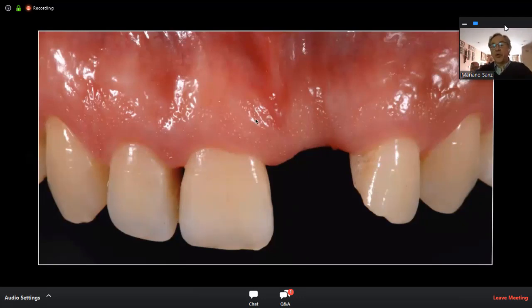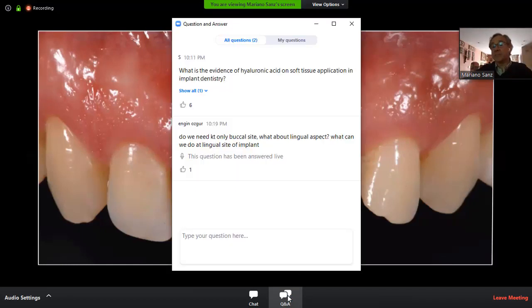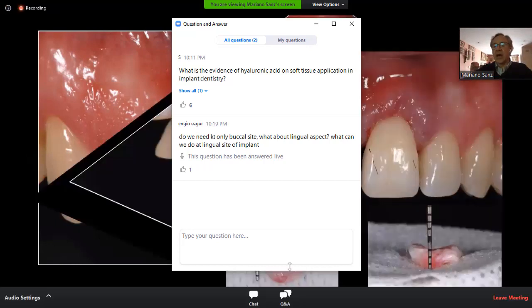And this is very important in a completely different location. If the augmentation of keratinized mucosa is important in posterior mandibular sites, the augmentation of thickness is crucial in maxillary anterior sites, because when we lose teeth, we are going to lose the root prominence, and we are going to end up with a concavity in the contour that, if the patient has a high smile, will result in a very esthetically poor outcome.